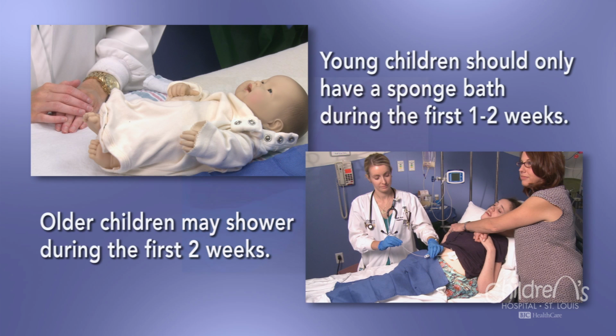Young children should only have a sponge bath for the first 1 to 2 weeks after returning home. Older children may shower for the first 2 weeks. This helps protect your child's surgical site. After 2 weeks, both younger and older children may have baths.